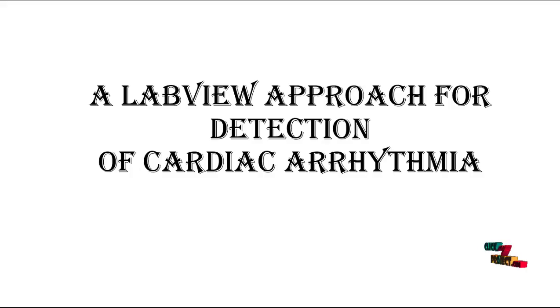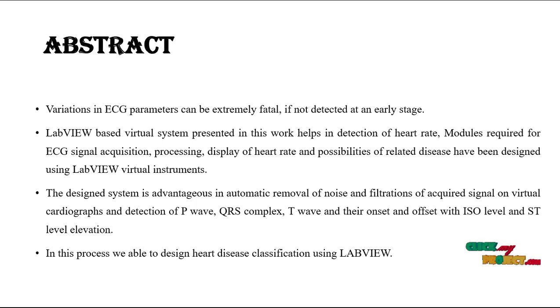Our project title is a LabVIEW approach for the detection of cardiac arrhythmia. The abstract: the variation in ECG parameters can be extremely fatal if not detected at an early stage. The LabVIEW-based virtual system presented in this work helps in the detection of the heart rate.